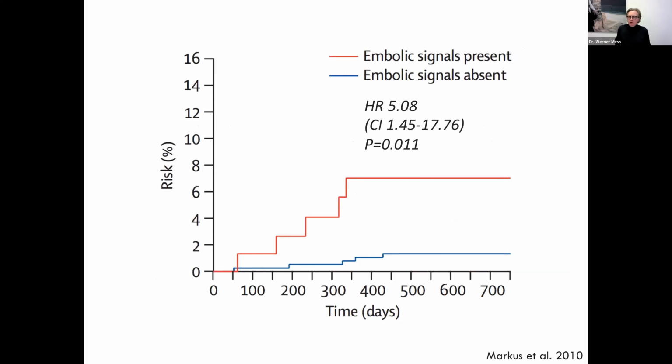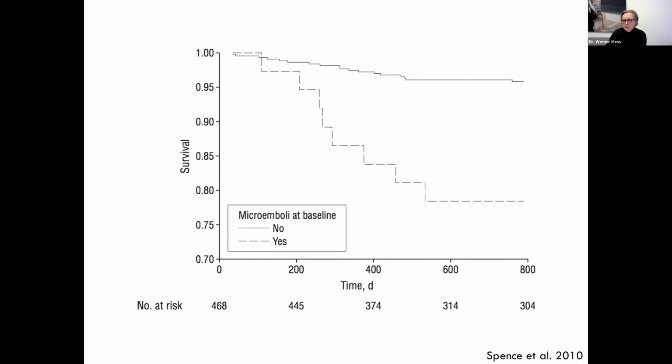So we switch now from symptomatic to asymptomatic carotid artery stenosis. And that is actually my favorite, I have to admit. This is one of the two large studies. Almost 500 patients have been followed up here. And again, you can clearly see that the emboli positive patients have a worse prognosis when compared to the emboli negative patients. This is the other study, from Canada. And it's the same story, emboli negative, emboli positive.